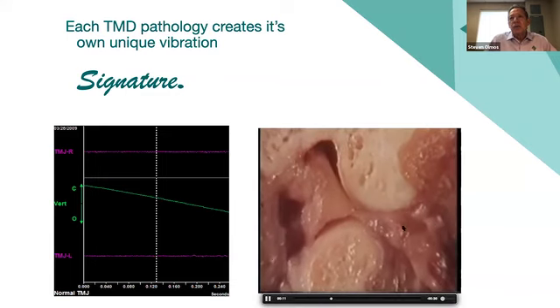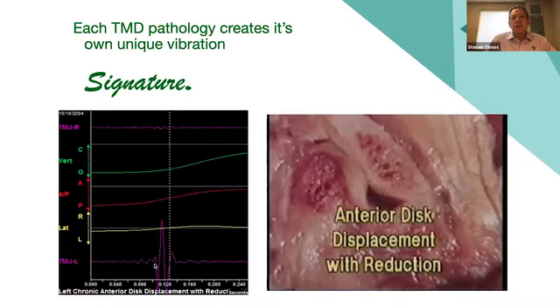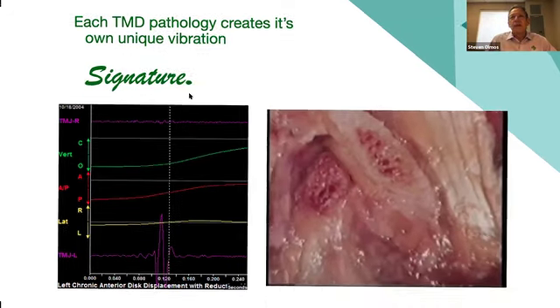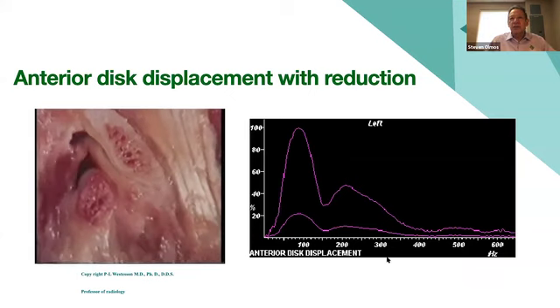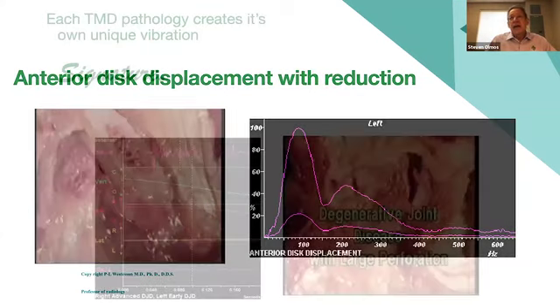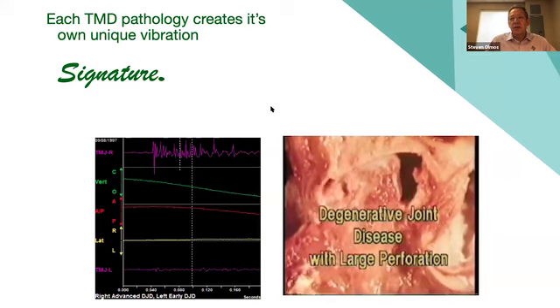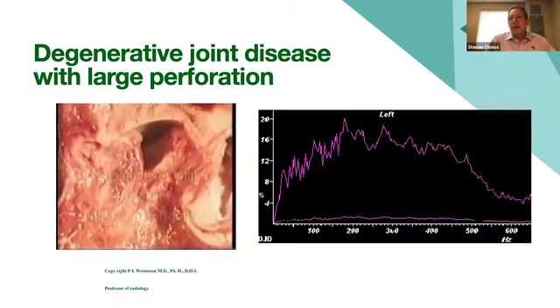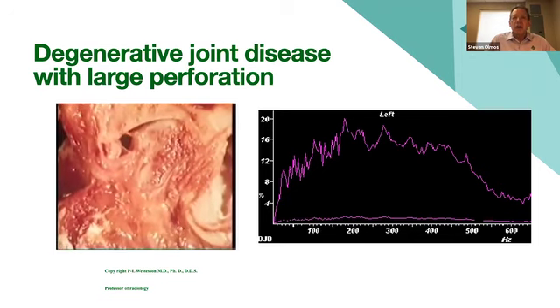So in a normal, smooth, functioning joint, you'll see there's very little vibration. However, in a disc displacement with reduction, you'll see a very high amplitude, low frequency vibration. So that's all soft tissue movement. And so we can actually quantify. Here's the disc moving, popping into place, and you get a visualization of how that works. Also, if you have a degenerative joint, you get a high frequency, low amplitude signal, signaling that this is a jaw that is broken down. And again, we have a frequency that is greater than 300 hertz. From 0 to 300 is soft tissue vibrations. From 300 and on are osseous.